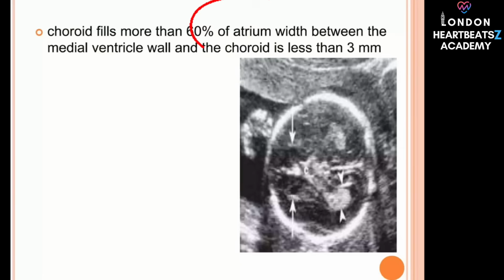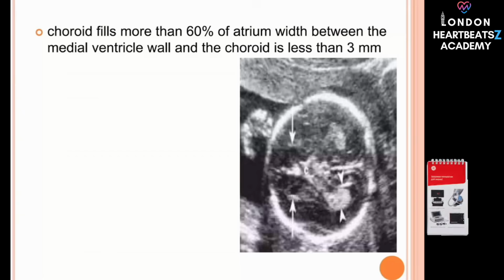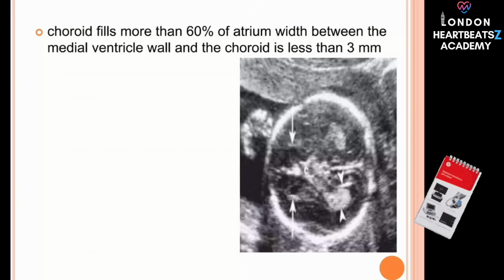This part of the ventricle is typically filled with the choroid plexus, which appears quite echogenic or bright on ultrasound. That bright structure within the ventricle. And there are specific visual cues and measurements they use in this view to assess if the ventricles are the correct size. Yes, absolutely. This is where you look for signs that the ventricles might be dilating, which could be an early indicator of potential issues. The sources provide key criteria for assessment here. First, the echogenic choroid plexus should normally fill more than 60% of the width of the atrium. More than 60%. Right. Second, and arguably more crucial, the space between the medial wall of the lateral ventricle, the wall closest to the midline, and the echogenic choroid plexus should measure less than 3 millimeters. Less than 3 millimeters.